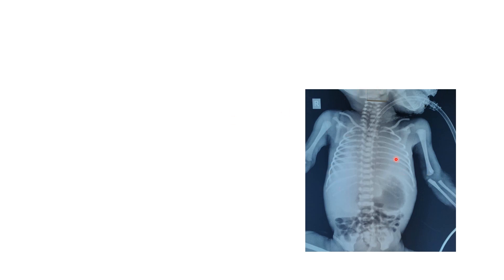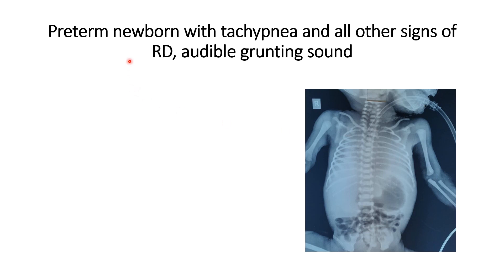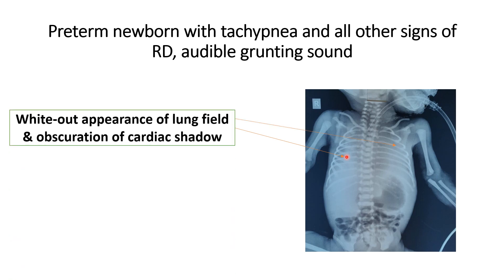Now look at this x-ray. This x-ray is of a preterm newborn who was having all the signs and symptoms of respiratory distress. In this x-ray, when you see the lung field, it is completely white out. You are not able to differentiate where the left and right heart border are. The terminology we use for this type of x-ray is white-out appearance of the lung field and obscuration of the cardiac shadow. Another terminology used whenever there is obscuration of the cardiac border — when you are not able to differentiate the impression of the aorta, pulmonary artery, right atrium, and left ventricle — is the silhouette sign.